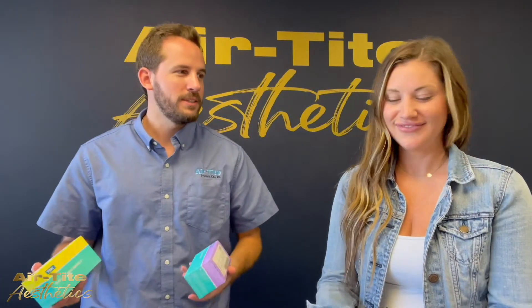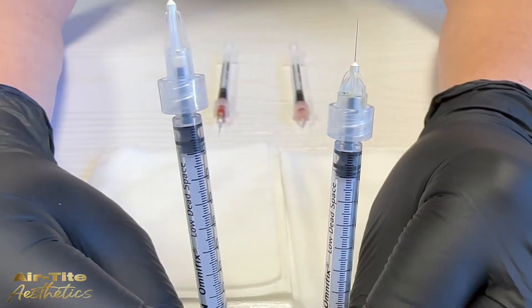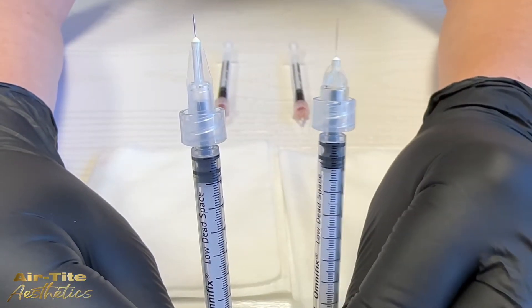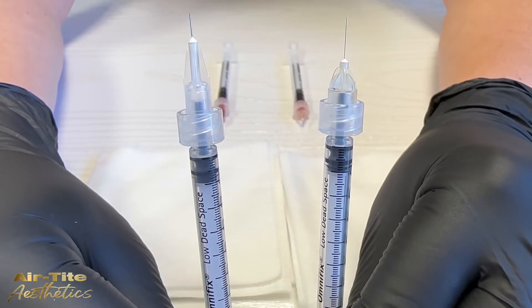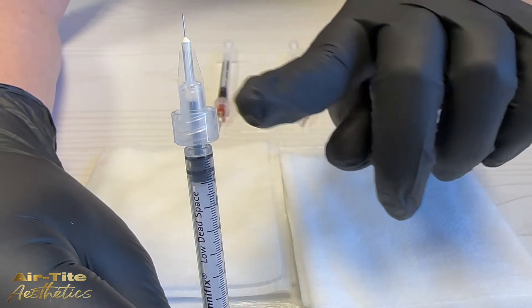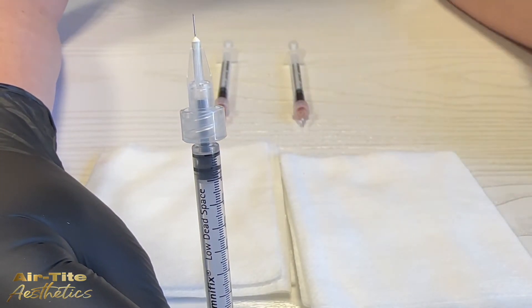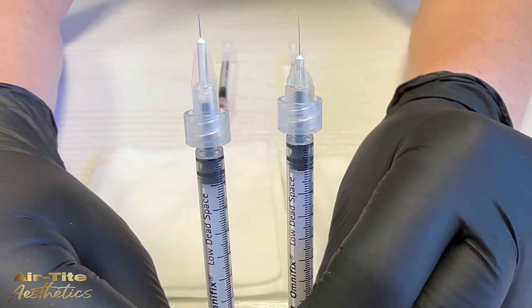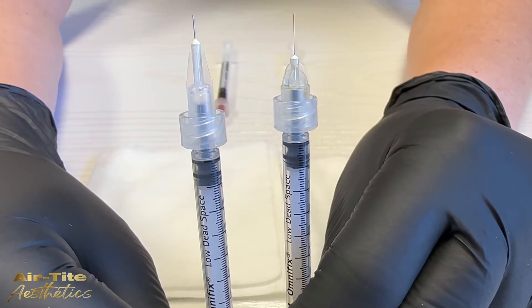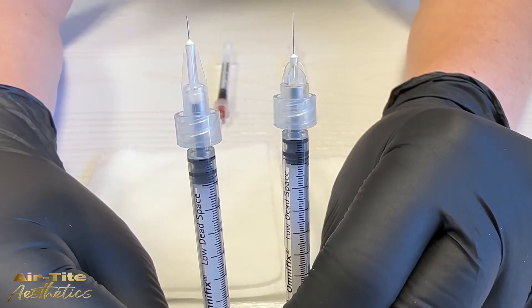So what is a low dead space needle? The easiest way to see what it is is to compare it to a standard needle. The difference between the two is the design of the hub, which is the fitting where the needle connects to the syringe. In standard needles, a lot of product is wasted inside the area of the hub, which is called the dead space. Low dead space needles were created to eliminate that gap, therefore saving product and money, especially when using expensive drugs like neurotoxins.